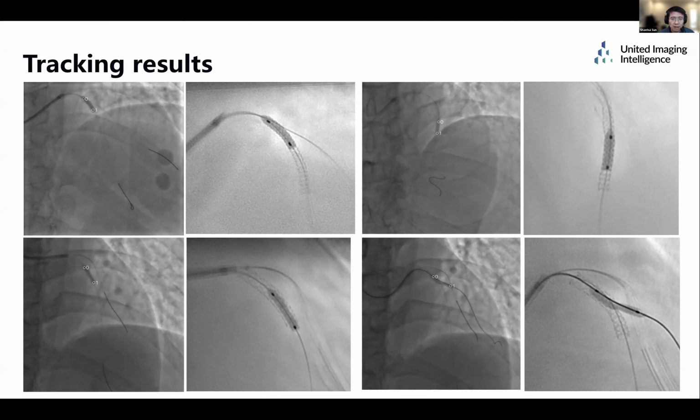Those are stent enhancement results derived from the landmark detection and tracking results. We can see much clearer stent visualization compared to the video results.